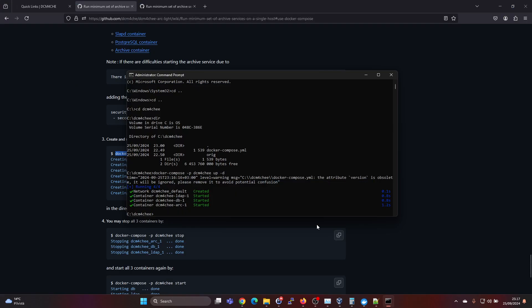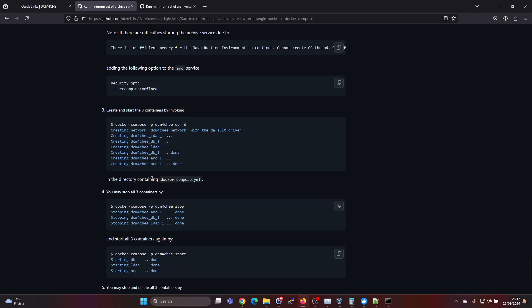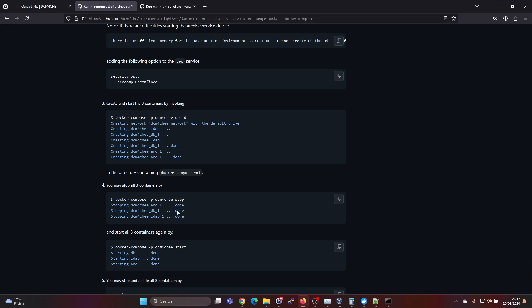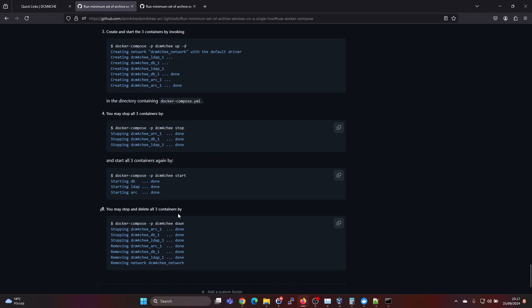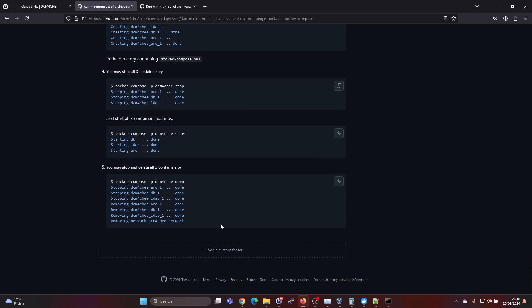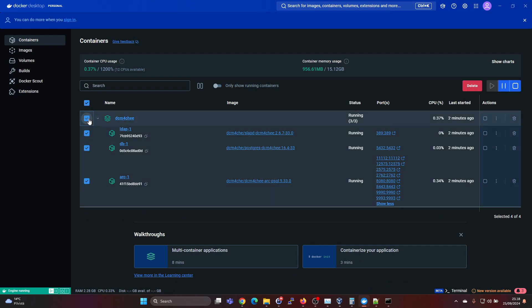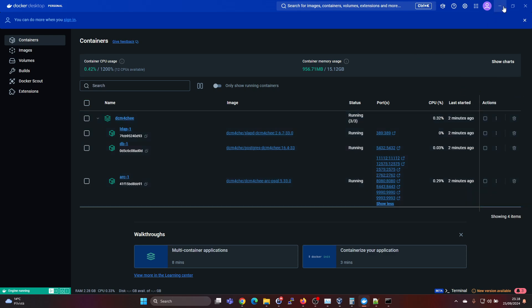And then we can go back to the instructions here. So they also give you the command line options for stopping and then starting again. And also for deleting the containers. But you can do that all via the Docker desktop here. You can right click and delete and stop and start. Everything is here.